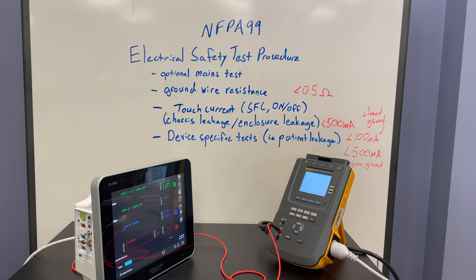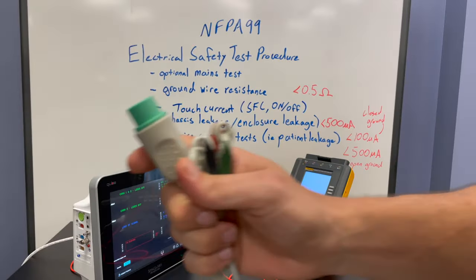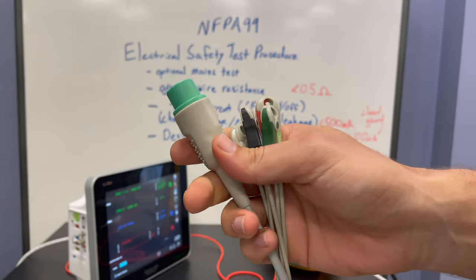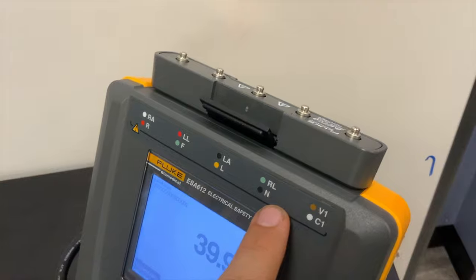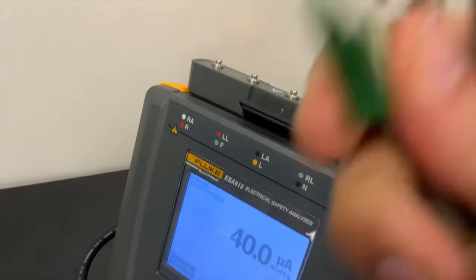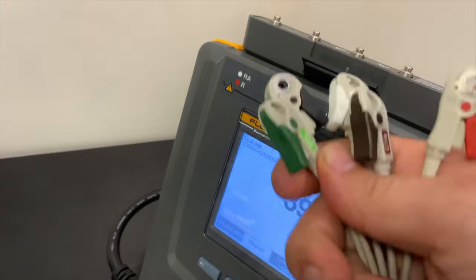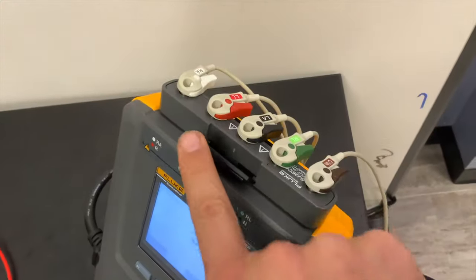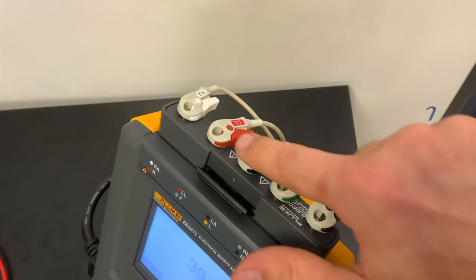Now let's go to the patient leakage test. For this test you're going to need to use your ECG cables. You'll notice the ESA-612 actually shows you the locations to put the ECG leads. Make sure the color codes on your ECG connection points match the connection labels on your tester — so the top row here matches these over there.